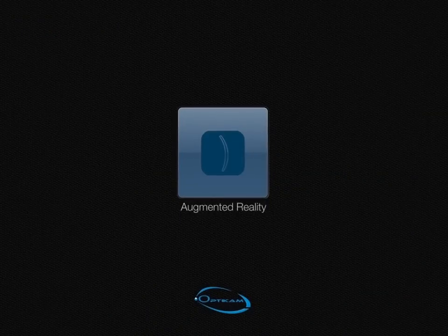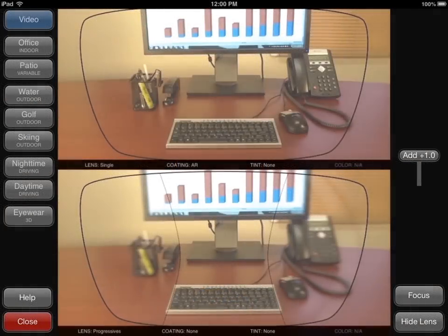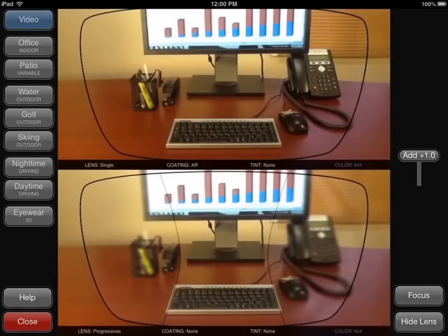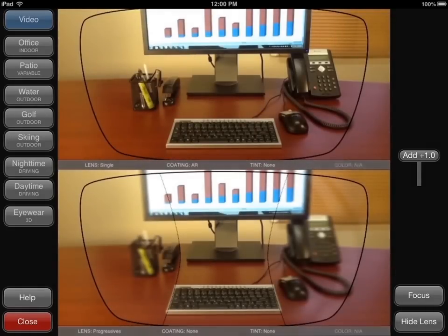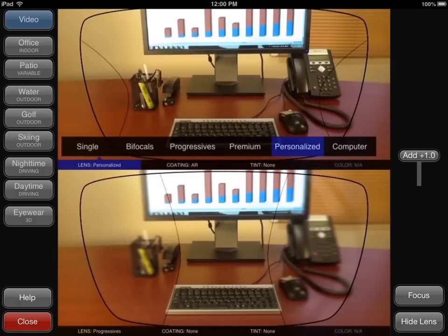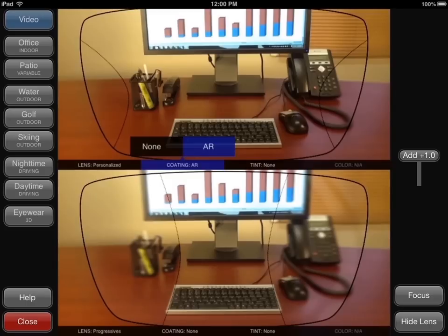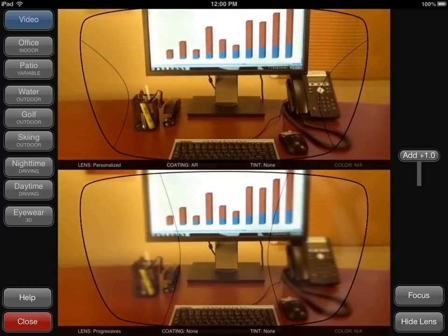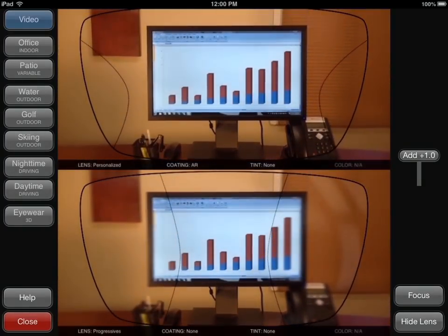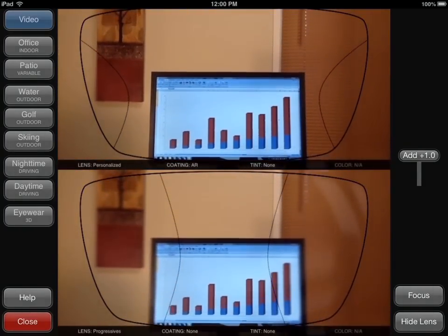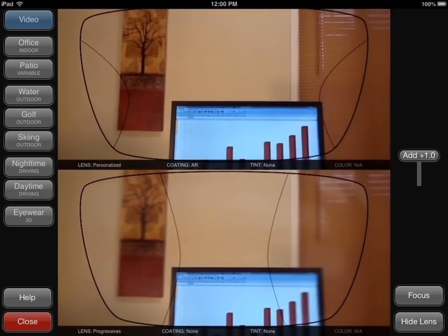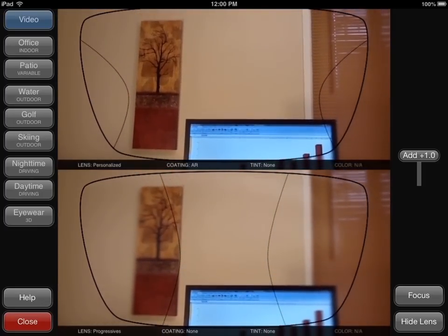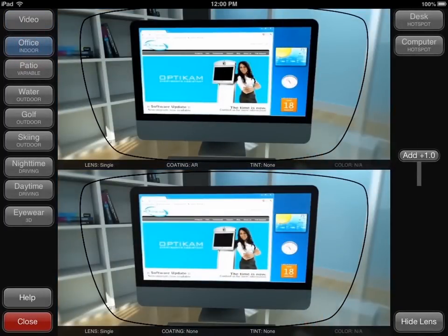When launching the Augmented Reality module, you are presented with two live video windows. Below each video window, several lens options can be selected: the lens type, the coating, the tints and colors. This live simulation showcases the benefits of various lens options using your office setting. Point the iPad around different parts of your office to highlight various lens benefits. You can also select pre-loaded scenes which simulate lens options in a 3D environment using the buttons on the left side of the screen.